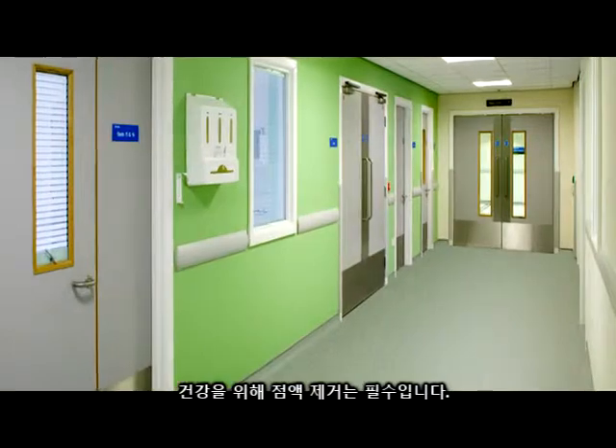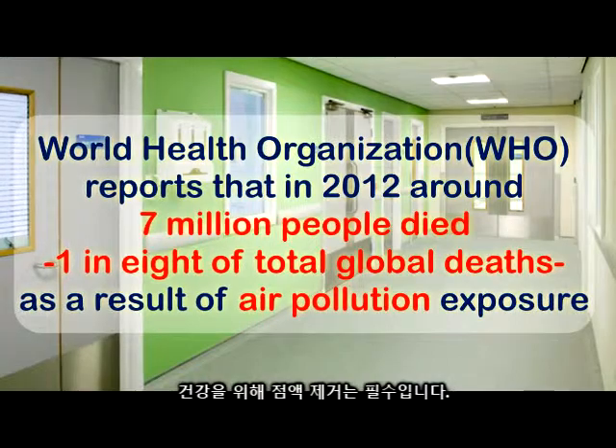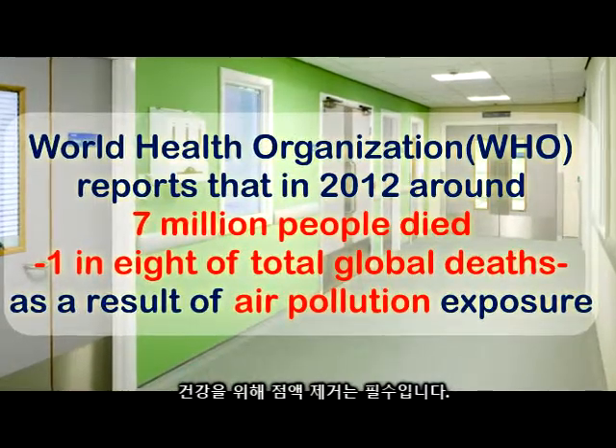This is one of the leading causes for hospital visits and death in the world today. In areas of high pollution, mucus removal is essential for good health.